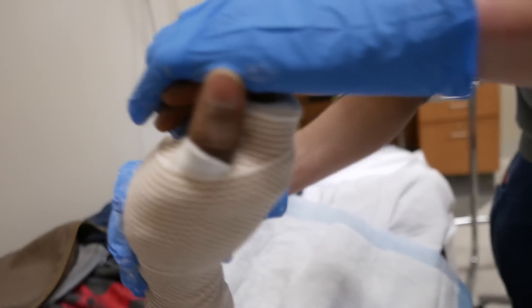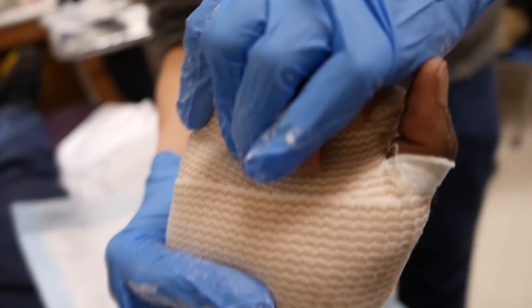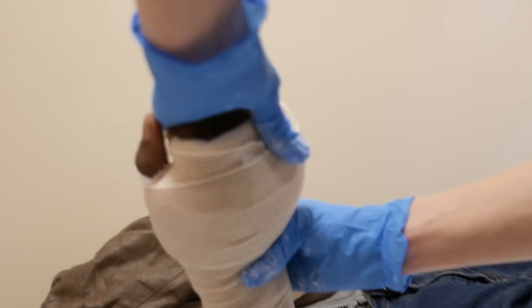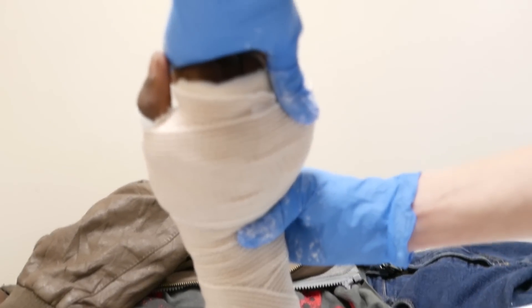So you'll get a 90-90 molding on the splint. The bone is good and stable — this is just for temporary protection until the patient can get in to see the plastic surgery attending who did the original Kirchner wires. Good job.